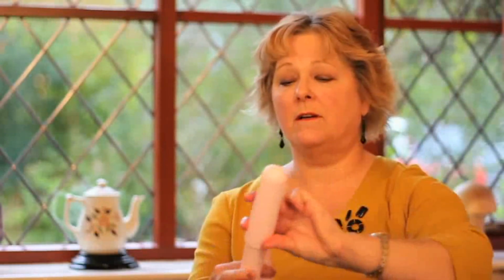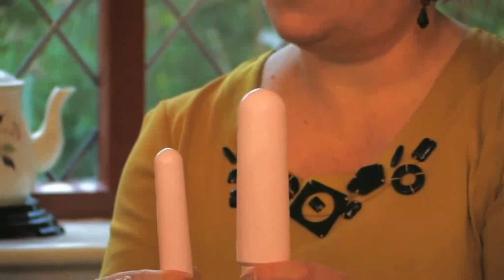Through a progression of steps, the woman can then go from that small size through to the next size and on through progressive steps to the larger and eventually the penis-sized trainers. It's important when you want to progress to the next size up that if you're comfortable with this size, that in the same session you progress to the next size up. The vagina is already relaxed and accepting of the first size, and it may well be more than ready to progress to the next size.